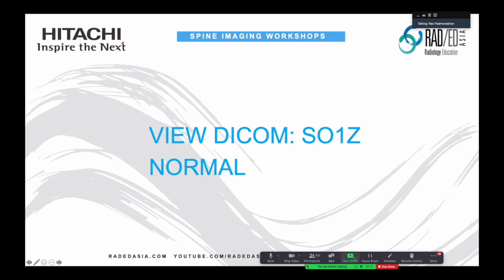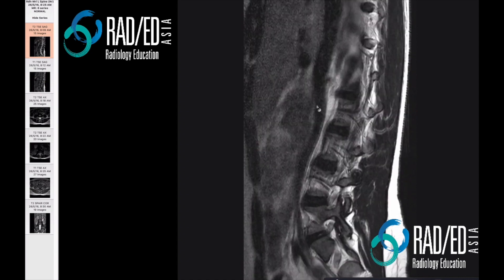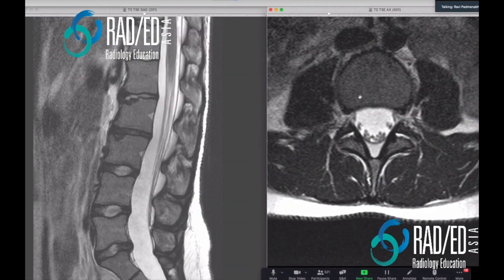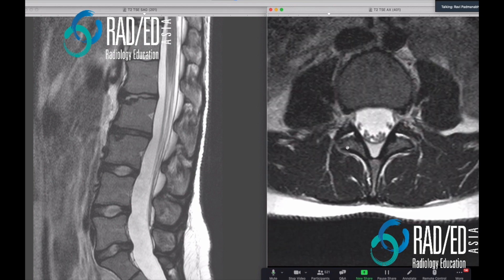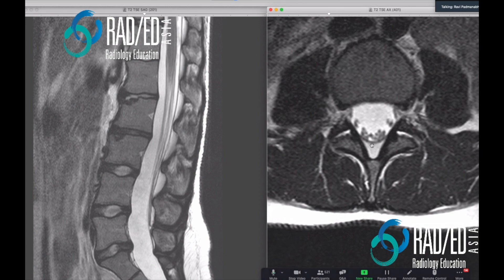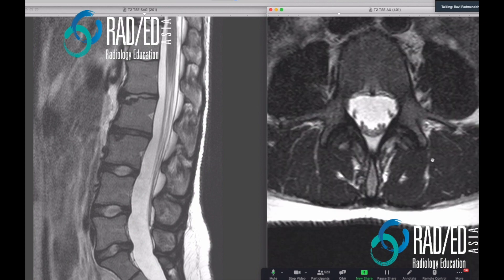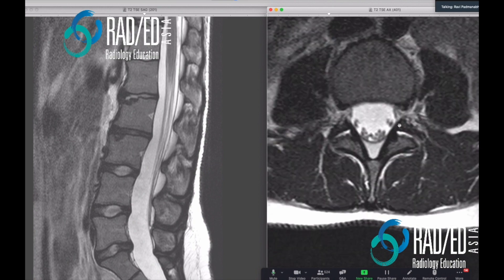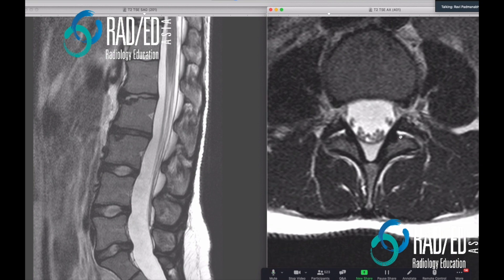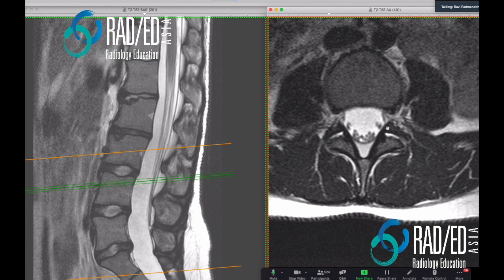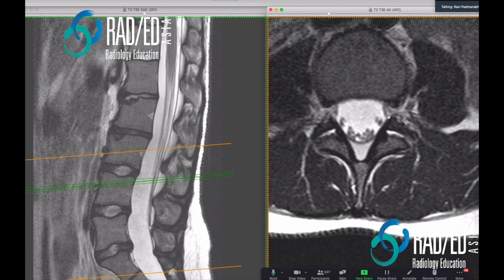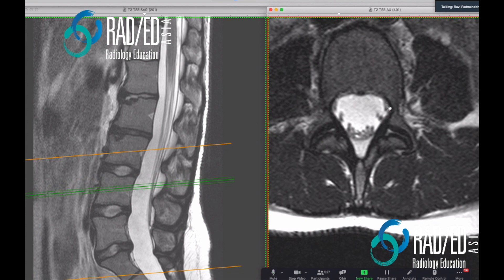Let's look at a normal case to begin with and go through the normal anatomy of the locations where these cysts can occur. Normal facet joint with a small amount of fluid — this is within normal limits. We'll see some later on where there's more fluid than normal. The ligamentum flavum and capsule are visible here as a combination. Most commonly, cysts come out of the facet joint and sit in this region — the subarticular or lateral recess, which is in this portion of the canal.